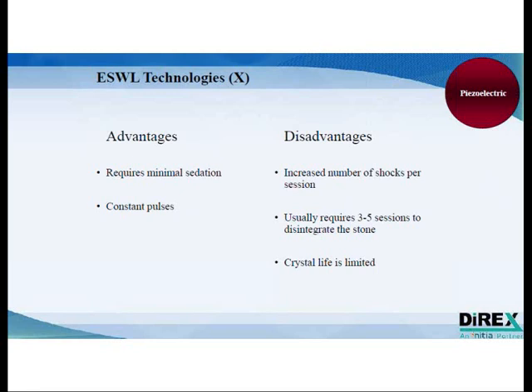The advantages of the technology is that it's not noisy and it doesn't require almost any sedation. Nowadays it lost that advantage because of the rise of the electromagnetic generation. And of course the disadvantages, as I explained, is the very short crystal life and the high cost of replacing the dishes. The treatment success rate is also very low.